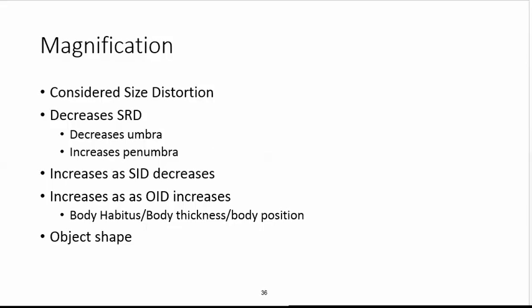If you have somebody who measures, say, 36 centimeters, then it's going to be 12 centimeters deep. So the difference is going to be the first patient who's, let's say, sthenic at 21 centimeters, their kidney and the kidney stone is potentially going to be 7 centimeters from the image receptor. So your OID is 7 centimeters. But if you have somebody who measures 36 centimeters thick, their kidney stone may be somewhere around 12 centimeters OID. So body habitus can change it.